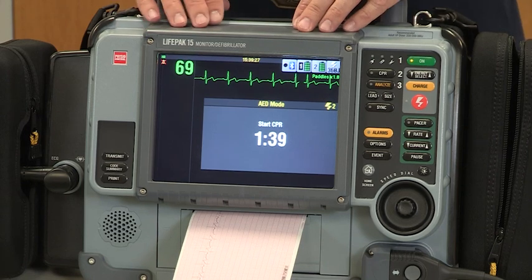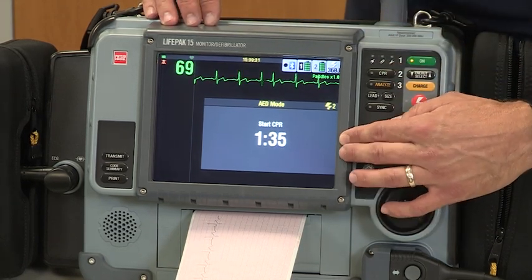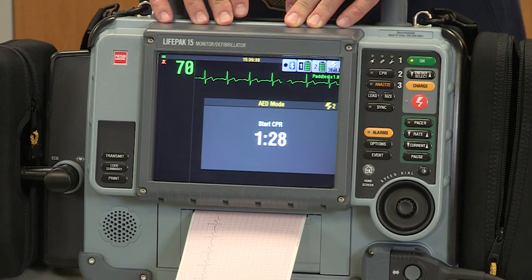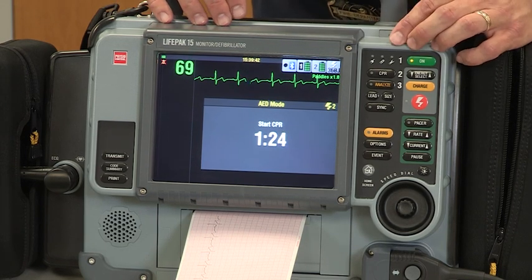In AED mode, you'll notice that you have an automatic countdown timer from 2 minutes. It'll give you a 2-minute cycle of CPR and then prompt you to check the patient again. In the manual mode, you'll have to provide your own timer, via a watch or a separate timer on the LIFEPAK itself.